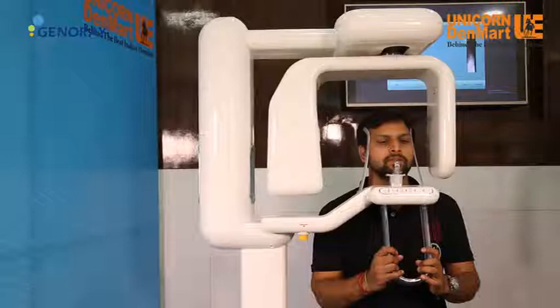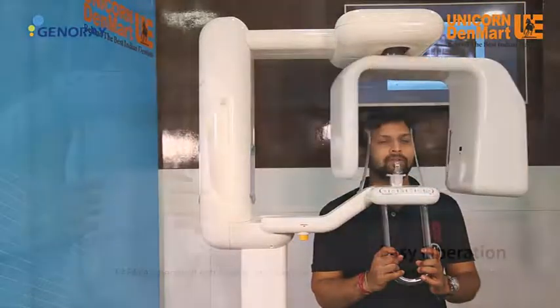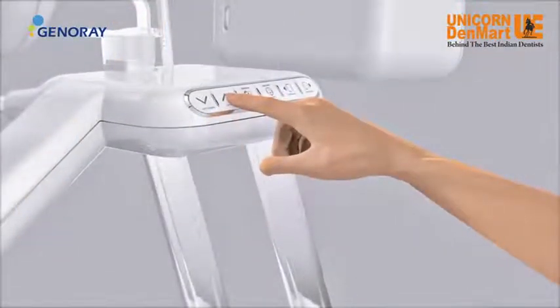So you get multiple advantages in a single OPG machine, coming with an unconditional warranty of 4 years.